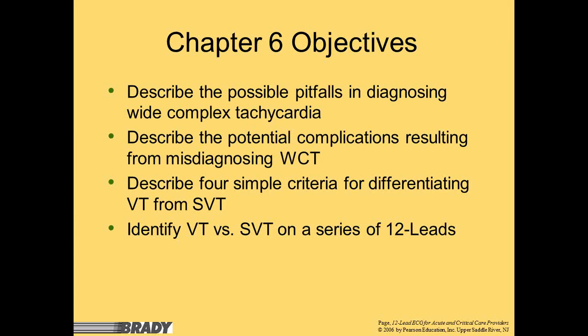So we'll talk about the pitfalls of diagnosing a wide complex tachycardia, describing the complications resulting from it. We're going to look at 4 different very simple criteria for differentiating VTach from SVT, and then we're going to identify both of those on a series of 12 lead practice strips for you.